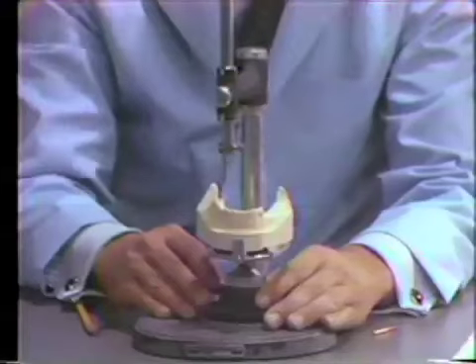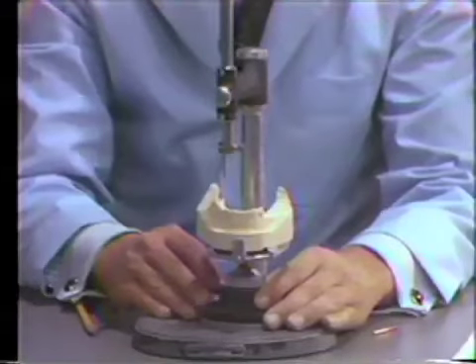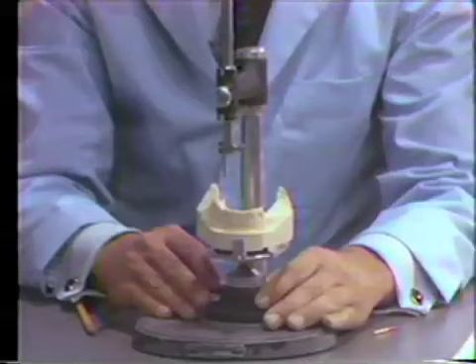Parallel to slightly undercut, perhaps. Very, very minimal. That's probably out of the potential range of our major connector, so I'm not too concerned about that undercut. It'll have to be relieved in that area slightly anyway. So now I have all my heights of contour marked on the cast, on the abutment teeth, on the potential indirect retainer teeth, and on the soft tissues.